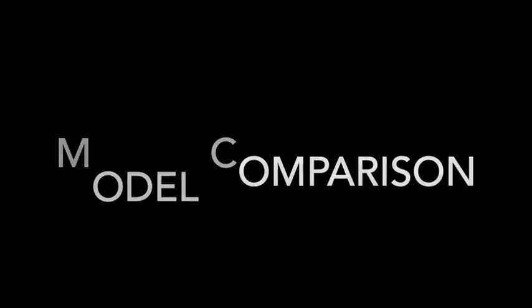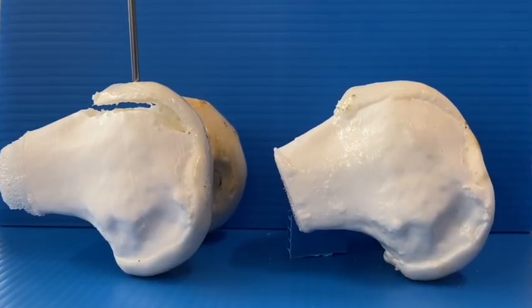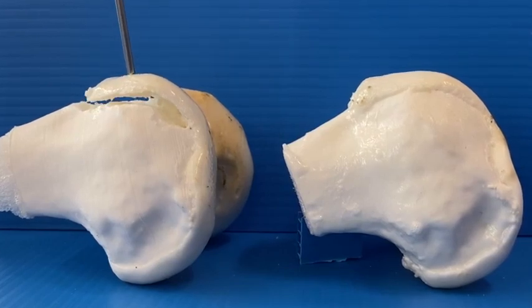We demonstrate the dampening and reduced flexibility of this recessed spur using a lateral viewpoint on the left edge of the screen. For comparison, a 3D printed model of trochlear dysplasia that has not undergone simulated surgical modification and still has an intact supratrochlear bump is shown.